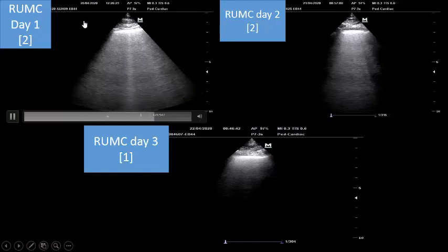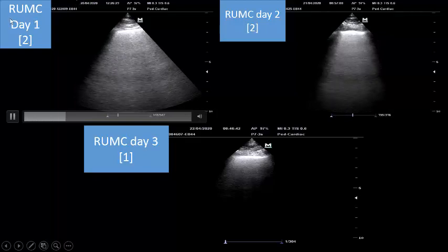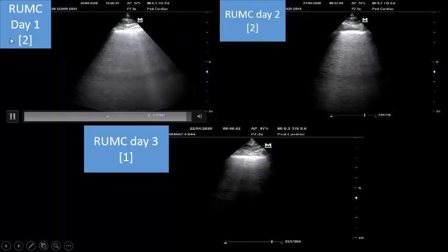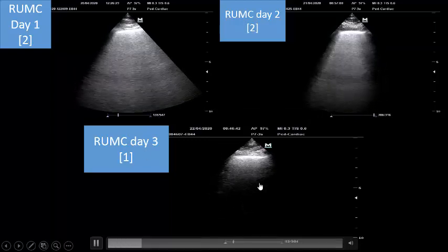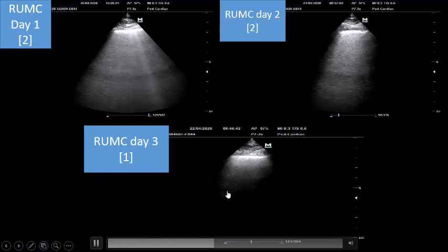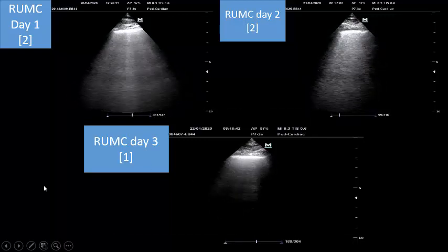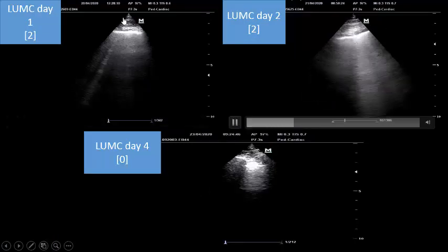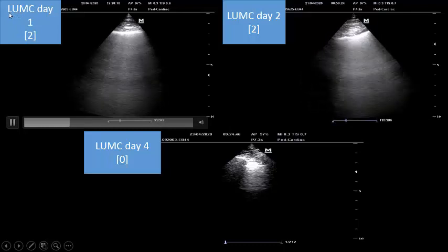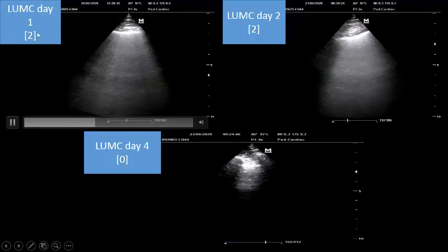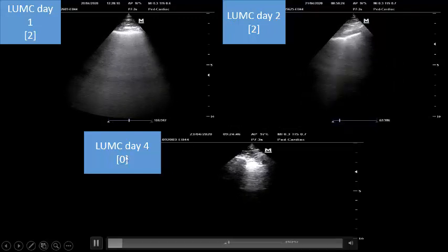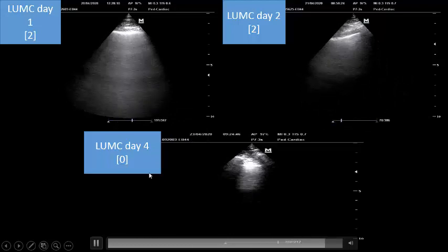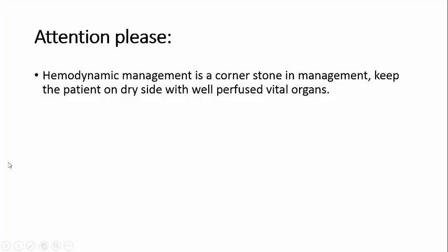Following our patient: on 20th April (Day 1), right upper mid-clavicular shows B-line density — score 2. On Day 2 (21st April), still dense B-lines. On Day 3, B-lines started to separate into very faint B-lines, denoting recruitment and improvement. In another segment, left upper mid-clavicular: Day 1 dense B-lines score 2, Day 2 still dense, Day 3 — A-line, score zero. We are following the progress of our patient.